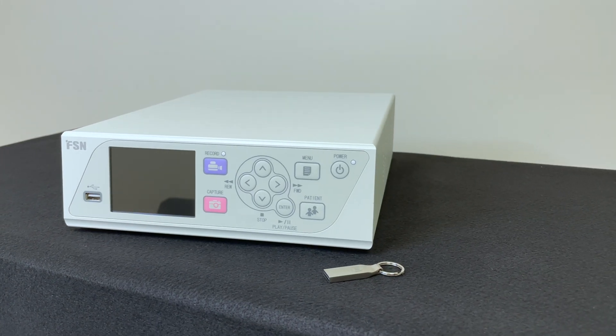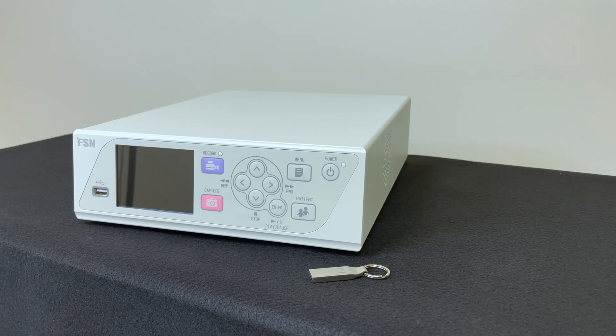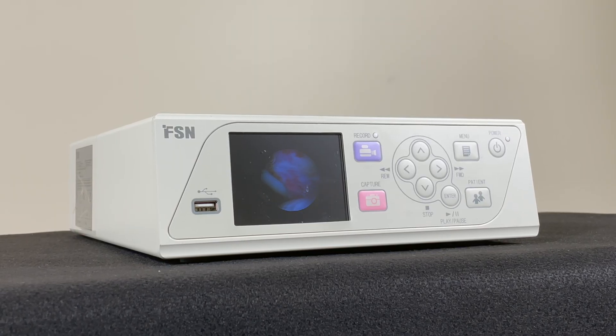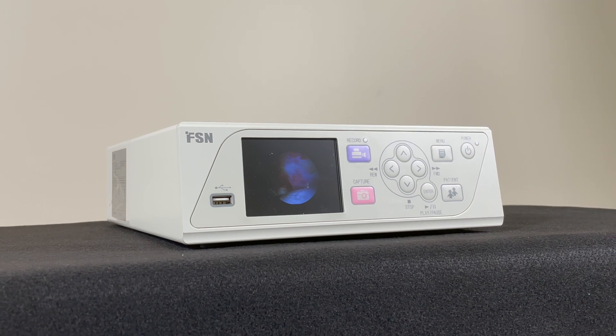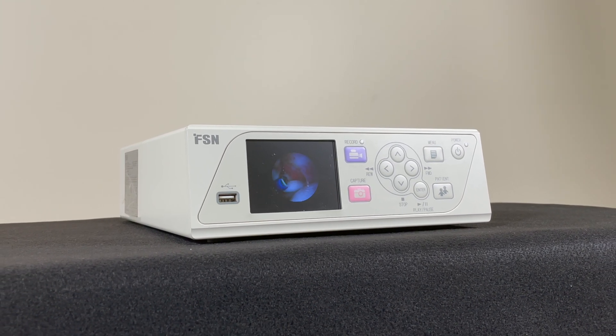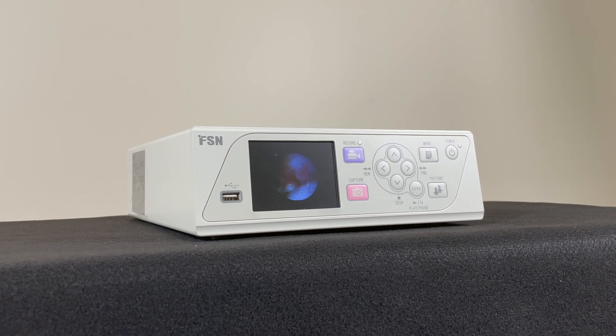And there you have three ways to record using the IPS-710A by FSN. Contact FSN or your local distributor for more assistance when needed. FSN — take control of your video.